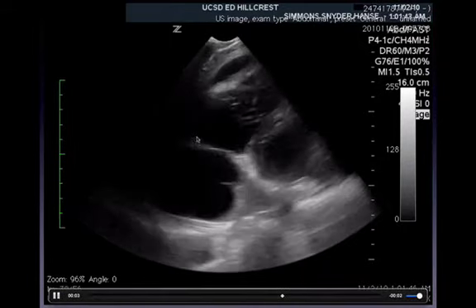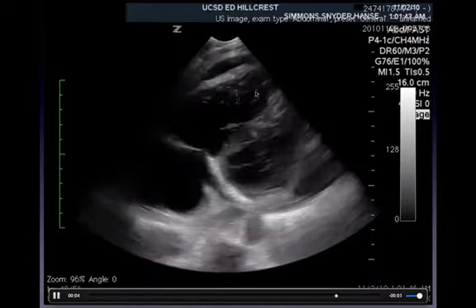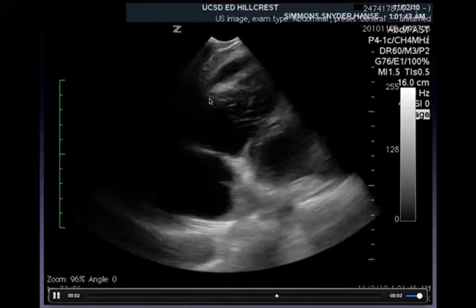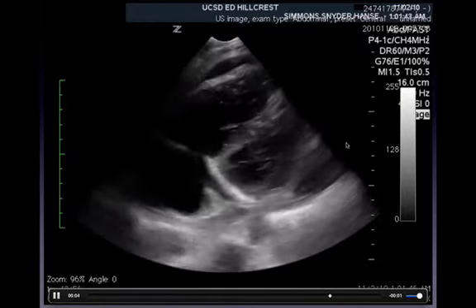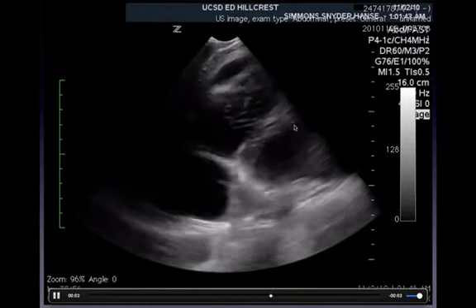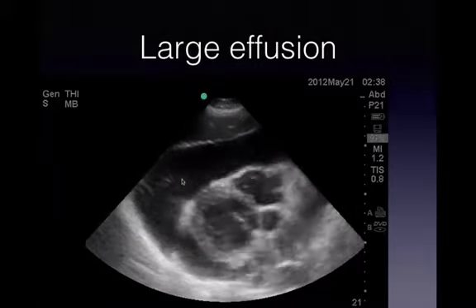And here, when we look at this, we see a lot of pericardial fluid here, and we see a bowing of the right ventricle here that partially collapses in early diastole. Here we see posterior pericardial fluid, which is always abnormal, and we see the left ventricle here. We have a very big right atrium as well seen in this view.